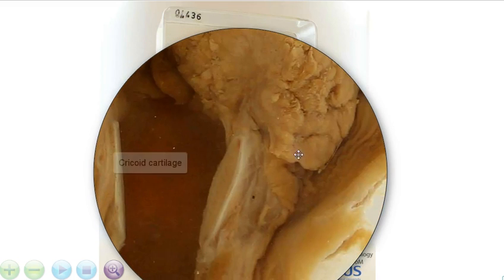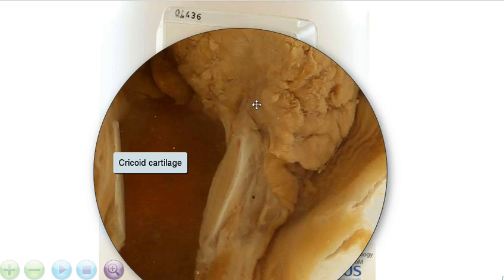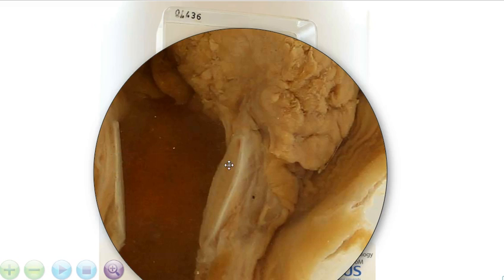And moving down a bit, we can see the cricoid cartilage and the tumour is close to it, but does not appear to be directly invading into this, not on this plane.